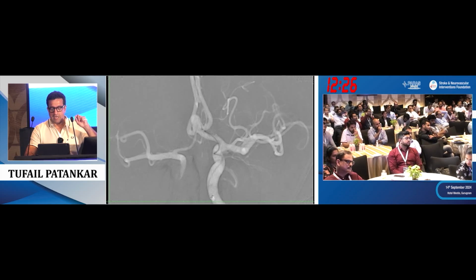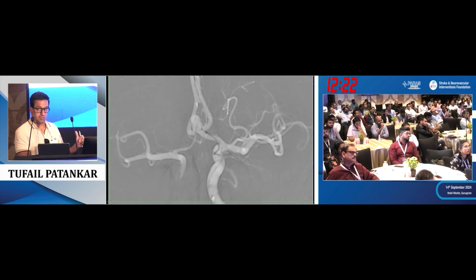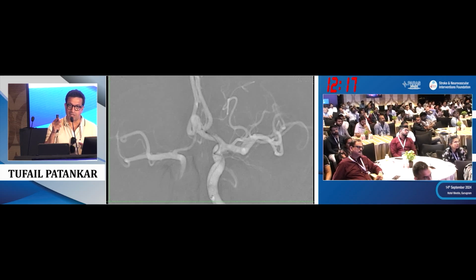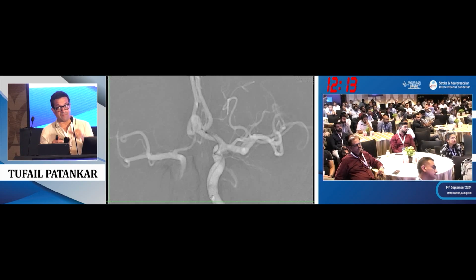And I'm giving it a little bit of a push there. This push is very important when you do contours. If you don't do it, your device may not necessarily know that it is stable. Either it can move in or it can move out.